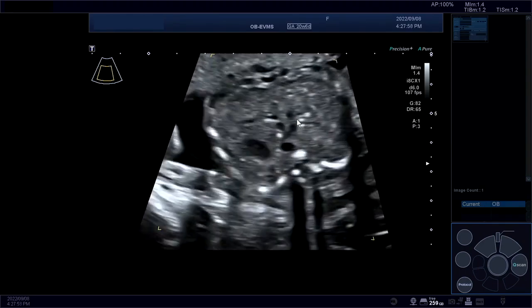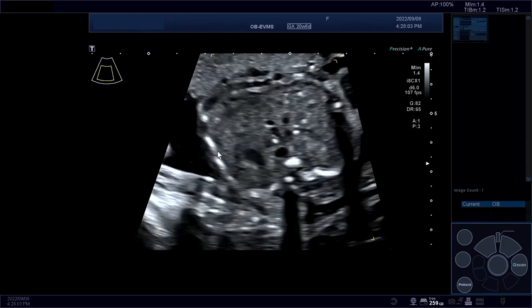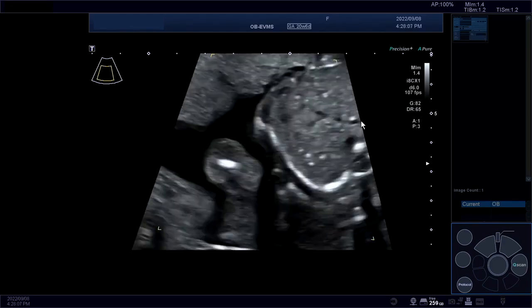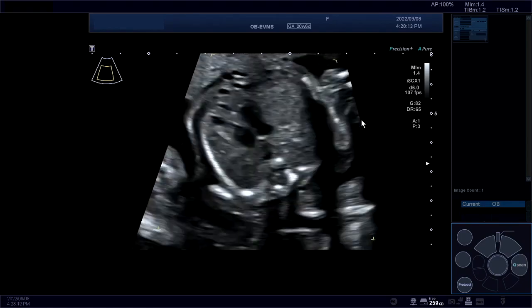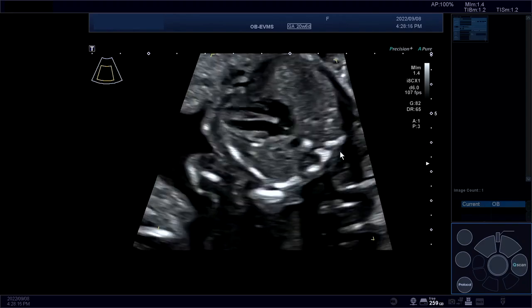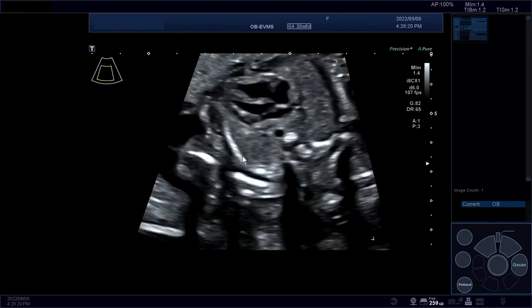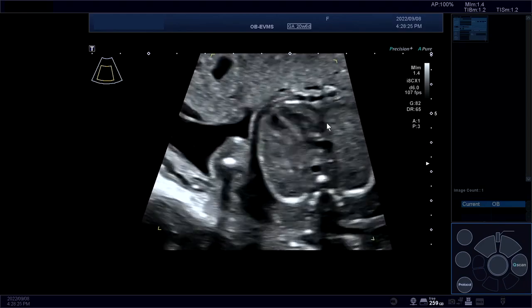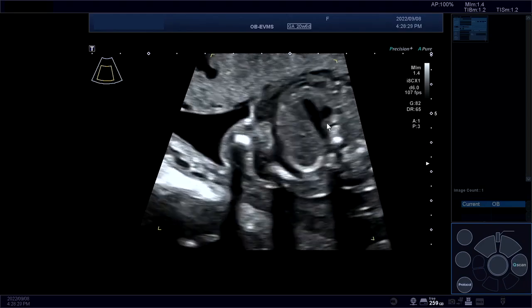Now look where I am now. The baby turned. So the reason I'm struggling to get a perfect 4-chamber view is, look at my ribs on either side. So what I need to do here, I need to go to the abdomen and angle down. And as I go in to remove the pressure on the abdomen, you see how I ended up with 1 full rib on either side, and now I have a perfect 4-chamber view. Clearly, really important, look at the periphery first, and then come back into what you need to look into. And from this orientation, again, this is easy to get the planes that you need to get moving forward.